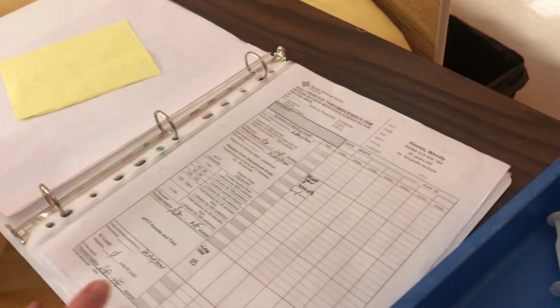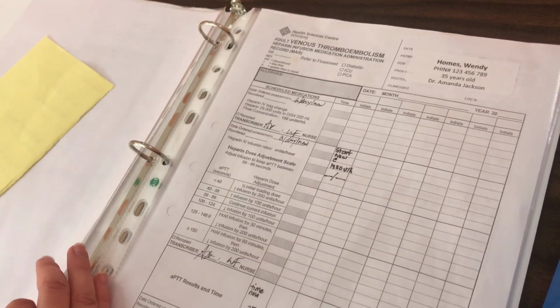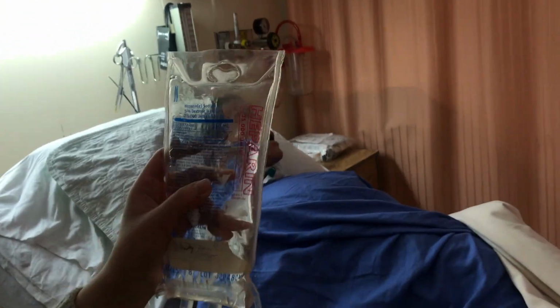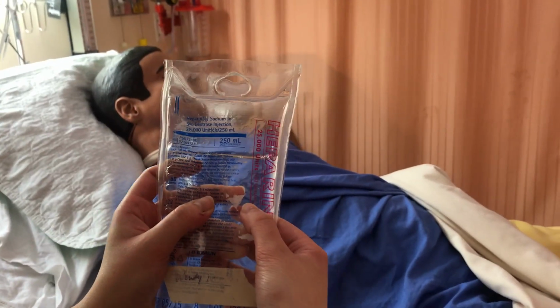And I'm going to compare this mark here to what I have hanging that the other nurse already prepped and primed for me. So I'm going to be giving heparin for a venous thromboembolism. So I have heparin here. It's 25,000 units within this bag. The concentration is 100 units per ml.